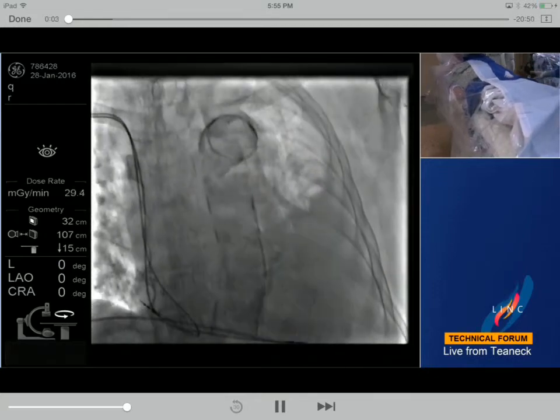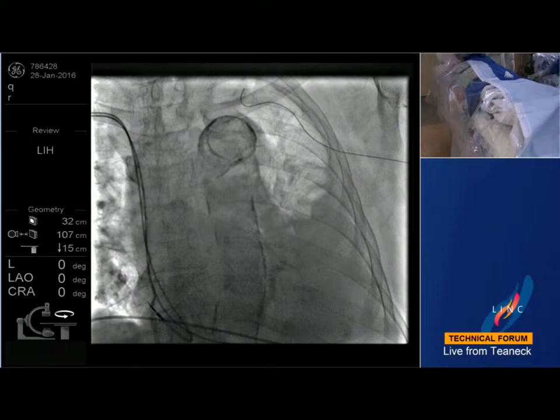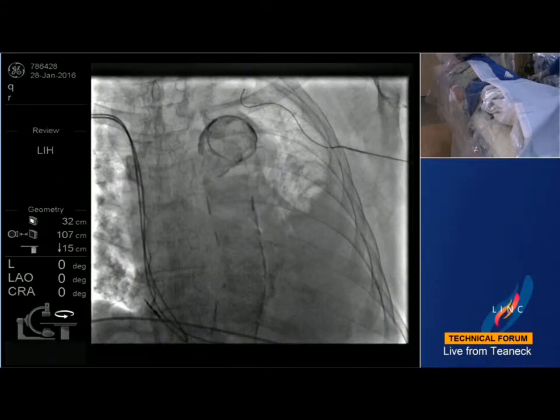We're actually also doing a transradial hemodialysis access case. I want to go through the history real briefly. You guys can see the history slides? Not yet. Okay, I think they're just getting set up for us. You just had the fluoro image. Okay, so we're not ready yet for that fluoro image. We were taking some preparatory images, getting access.